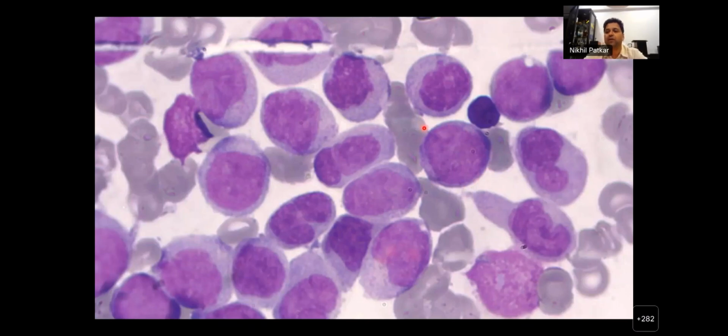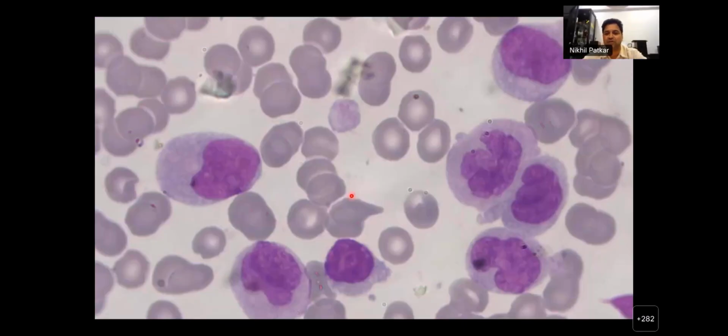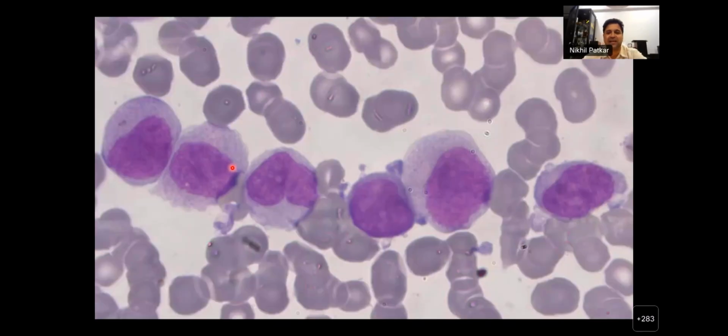Monoblasts? These are normal myeloid blasts. There is no monoblast among them. We saw monoblasts, abundant cytoplasm and all of that. None of that is there. These are normal myeloid blasts. And then there are these. Once again, what are these? Yes, they are normal monocytes. Okay, so you are getting to be a hematopathologist. Very good. And again, promonocytes. So you have all kinds of monocytes. You have promonocyte-like cells and so on.